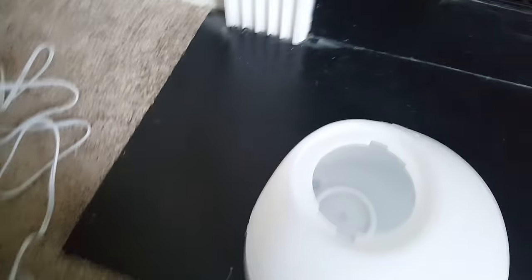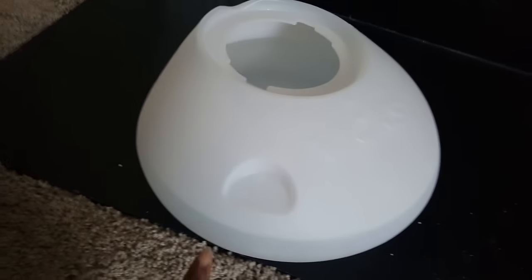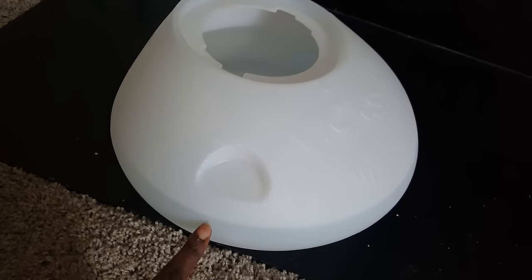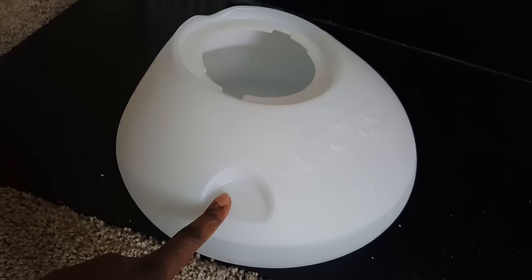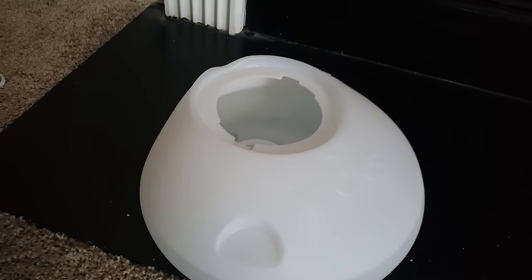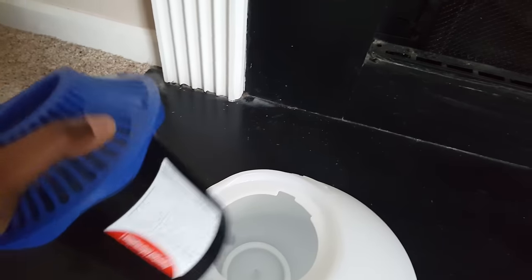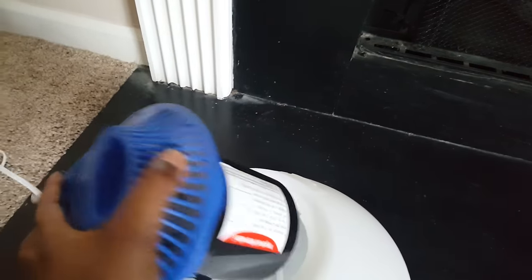What I did is I filled this container up to here, even though the max is here — I didn't want to go all the way to max. So what I'm going to do now is to put these parts right here inside.